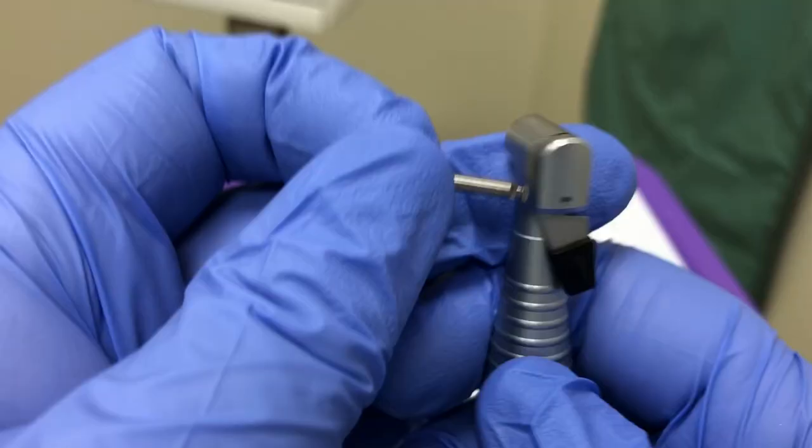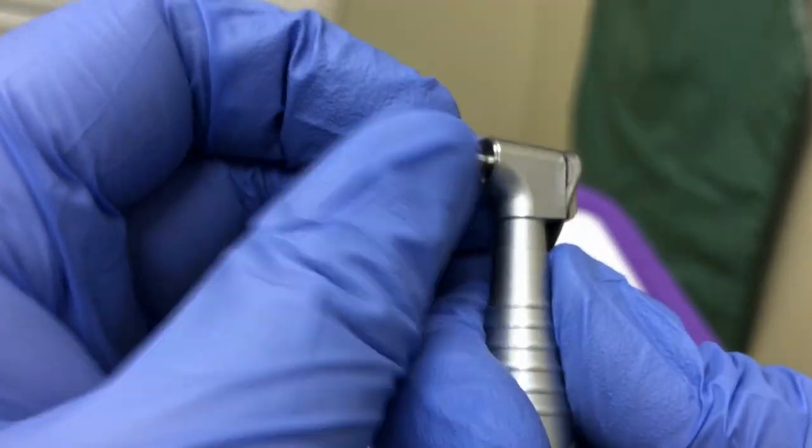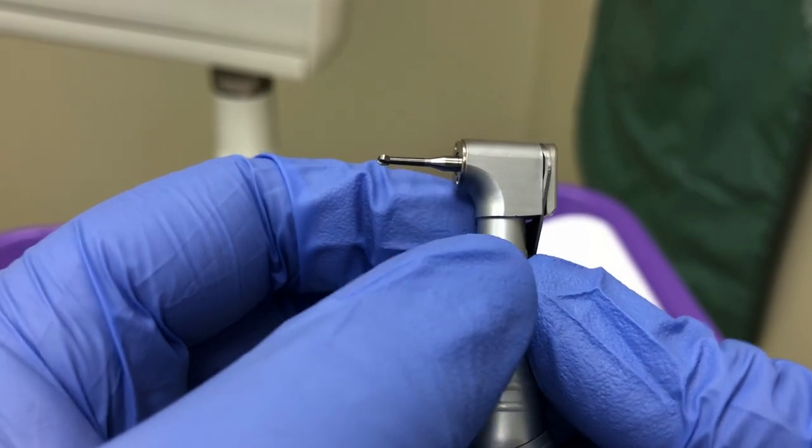To open the locking mechanism, swing the piece on the back of the handpiece. Fully insert the burr into the handpiece. Once it is in, lock your handpiece.